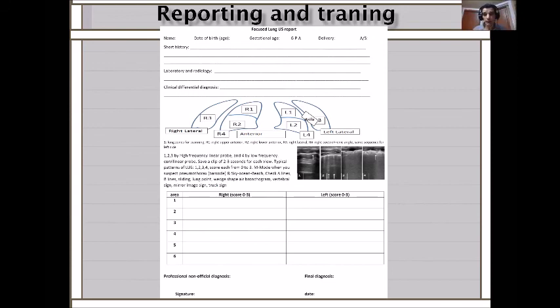We call it echo, but it's not a structural echo. It's not echo for cardiologists. We do echo for a purpose within a strict protocol. We don't do free echo. We have a problem and we need to see if the heart is contributing or not. It's point of care. So you have a problem, you have edema, and you need to know, is the heart pumping or not? That's all you do. You don't look for these structures. So it's a very strict way.